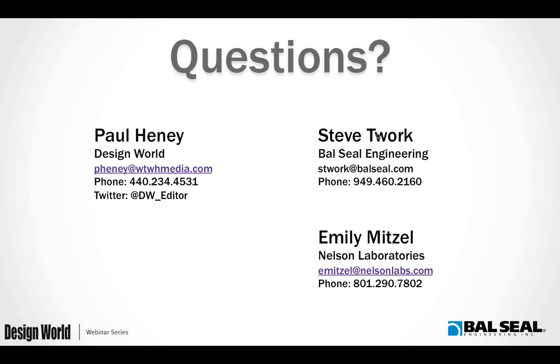Emily, I believe this one is oriented to you. What residuals would you recommend for testing for a device that would be used for a hip replacement? Yes. For hip replacement, we would want to make sure that we are using a blood soil that would contain all the components that the devices would come into contact with during that procedure. And we would want to make sure that we fully immersed or handled all the devices and actuated them appropriately, exactly how they would take place in the surgical procedure. We would work with that medical device manufacturer and have them explain to us fully the surgical procedure so that we can mimic that appropriately.